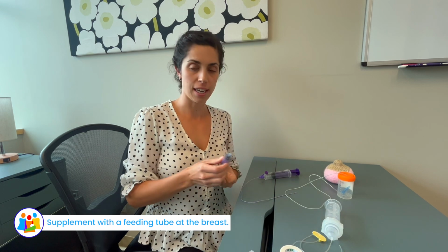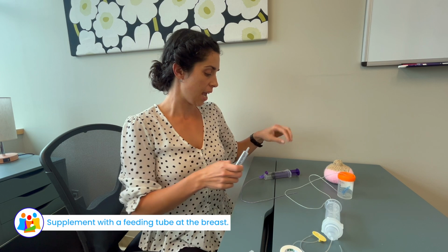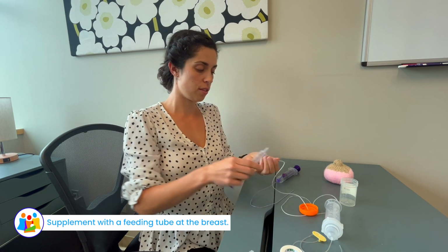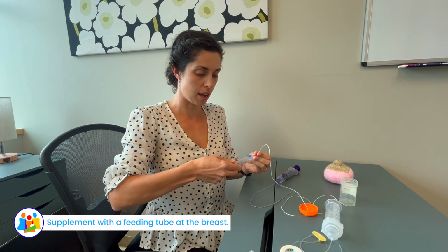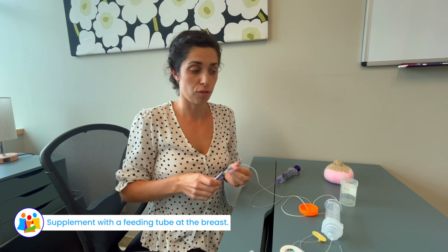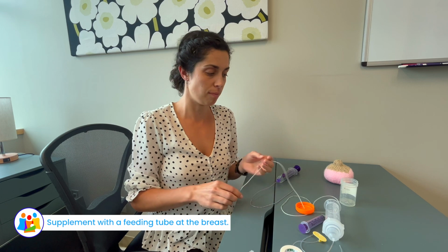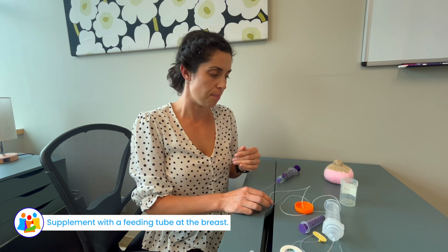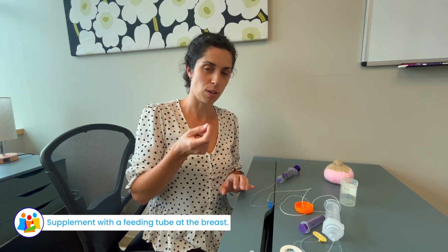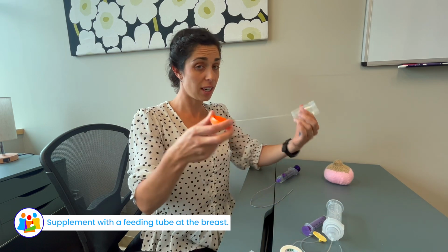For cleaning, I give the families a plain feeding style syringe, and it is just attached to the bottom of the tubing and washed with hot soapy water between feeds, and then aired out. And the tubes are usually good for certainly many feeds, often weeks, even months. I've had families find that they work fine for. And some families find they get a little bit of sediment or stiffened, and then that's when they would rotate to a new set. But it's very inexpensive.